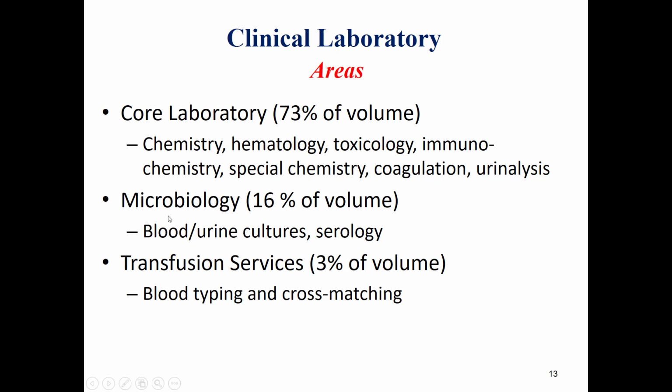The microbiology constitutes around 16% of the load volume. This includes blood and urine cultures, serology, and other areas. We have also another area in the clinical laboratory, which is transfusion services, which constitutes around 3% of the load volume. Its tasks include blood typing and cross-matching.